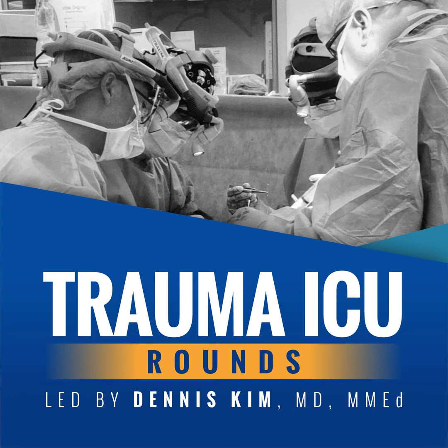Another important goal of mechanical ventilation is to reduce the work of breathing. In the normal, sedentary, steady state, less than 4 to 5% of our cardiac output is going to our diaphragms and the muscles of respiration. You can imagine in someone who's in septic shock or really sick, that amount can go up to 20% of your total cardiac output. So that's a fifth of your blood flow and oxygen delivery being diverted away from other critical organs like the brain, the heart or coronaries, and kidneys just to support the work of ventilation.